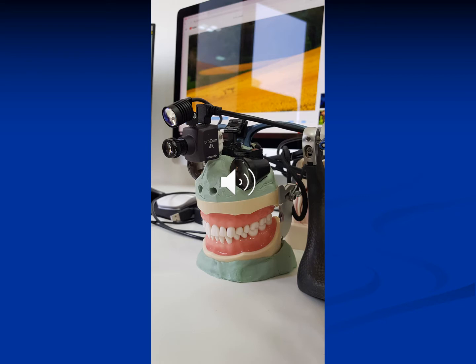Articulators are considered to be a very important tool in prosthodontics, and it is one of the most important armamentarium that is used to construct our prostheses. As I said before, whether it's a complete denture, full mouth rehabilitation, fixed or removable restoration, it's as important as any other tool that you use, including your loupes, your light, your mirror, etc., in the context of providing a restoration that will function in harmony with the oral structures.